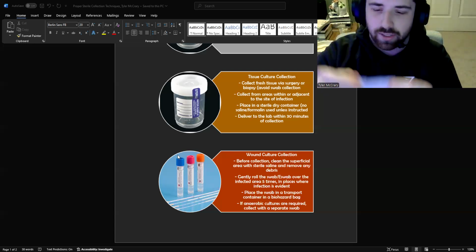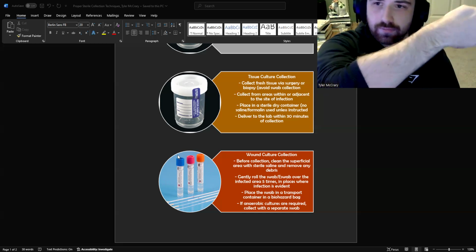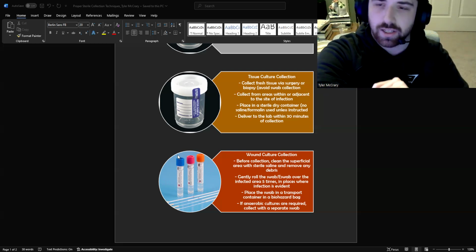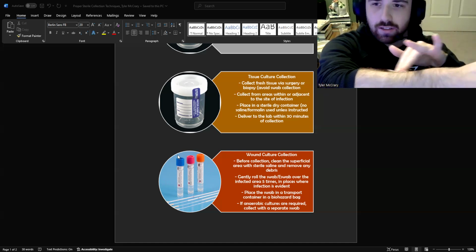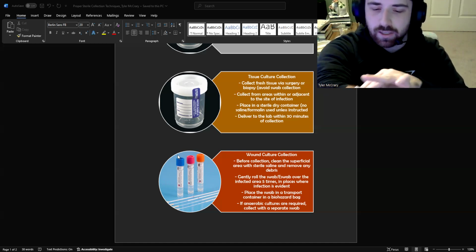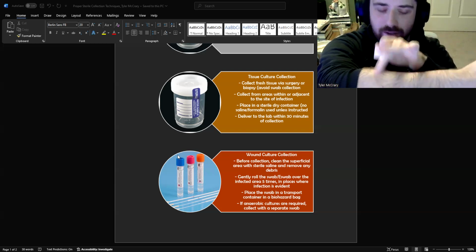We have these little wipes here. These are just sterile saline wipes. Let's just say that this area right here is where my infection is. For the superficial area, we don't want to put it in the actual infection site. You want to just clean the skin around it. That way you remove any of the normal skin flora. You don't want to contaminate the swab with anything that's not causing the actual infection. So I rubbed my arm around the area of infection.